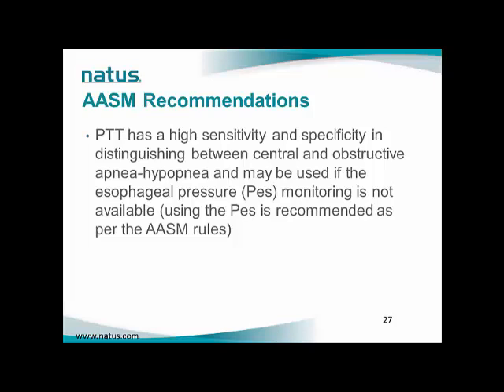PTT signal provides a non-invasive measure of the inspiratory effort and microarousals that can be used to document obstructive sleep apnea syndrome. It requires recording ECG in order to recognize the R wave, and the pulse oximeter to analyze the photoplethysmography signal, assessing the arrival of the pulse wave to the periphery.